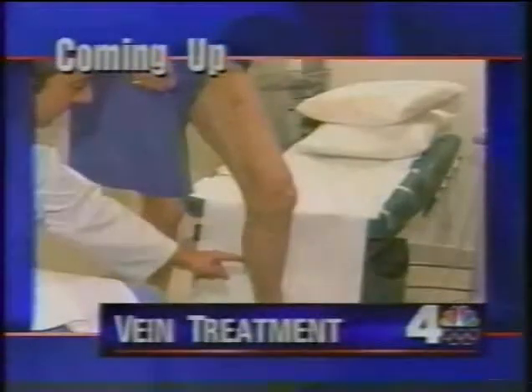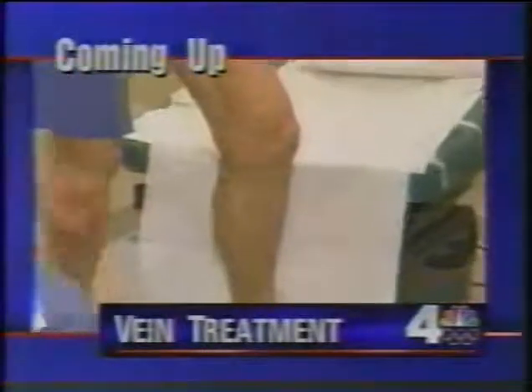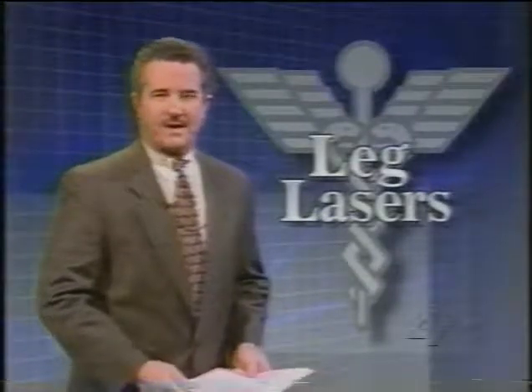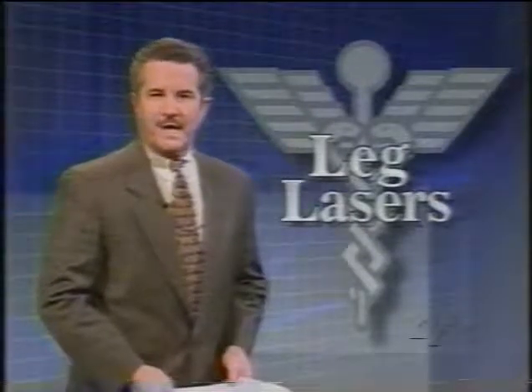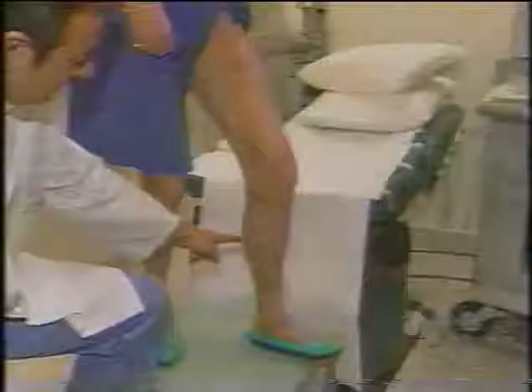Also a new laser treatment for varicose veins. Later, a new laser treatment for those unsightly and painful leg veins, varicose veins. If you suffer from varicose veins, you probably know that you can have them injected or lasered, depending on their size and location. But most big varicose veins come from the failure of a large vein in the groin, one that had to be surgically stripped out until now.